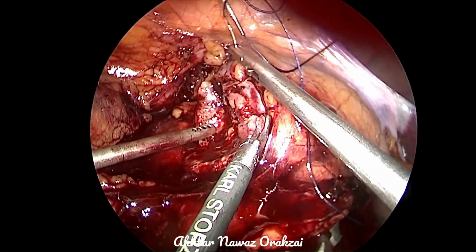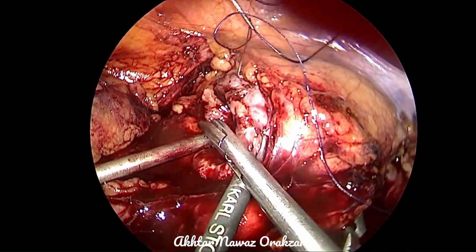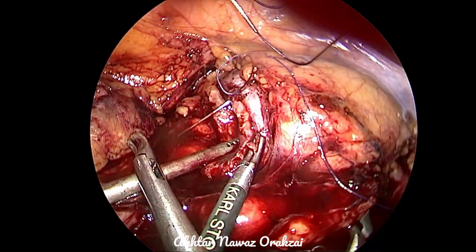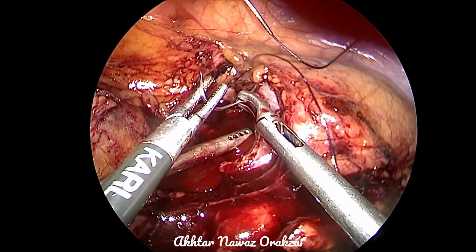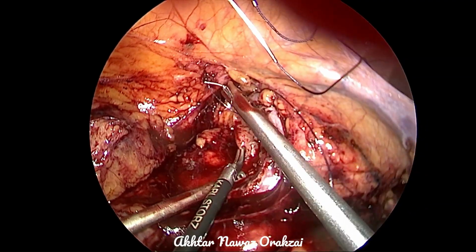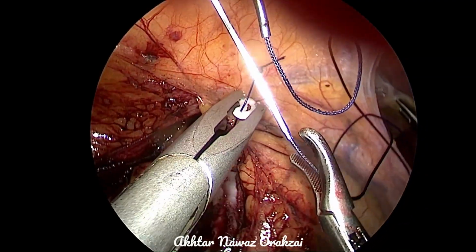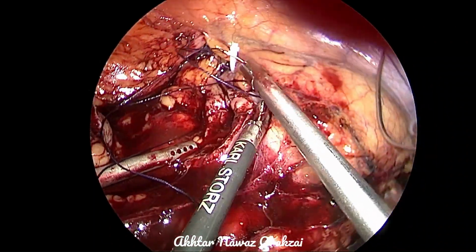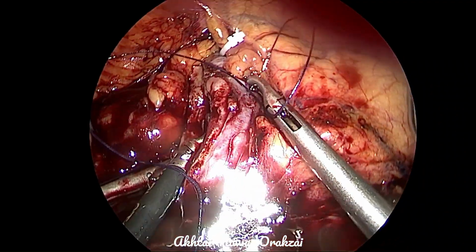Instead of placing the tumor in the bag for retrieval, we have placed it along the lateral aspect of the lower pole, because the ischemia time is really important. Since we are saving the kidney, we are saving it in a true sense, instead of wasting time.